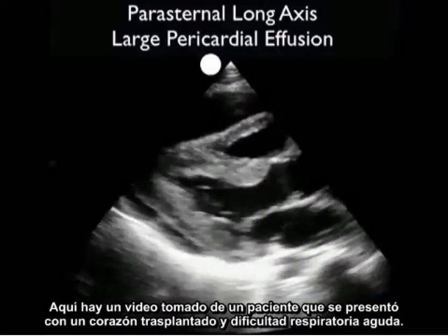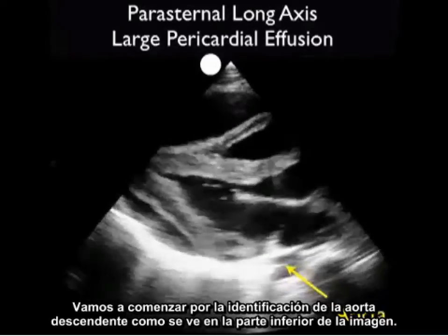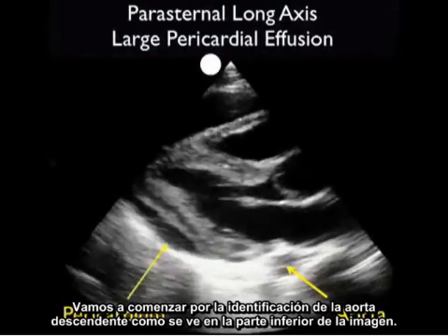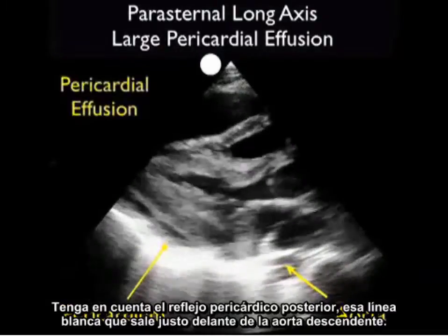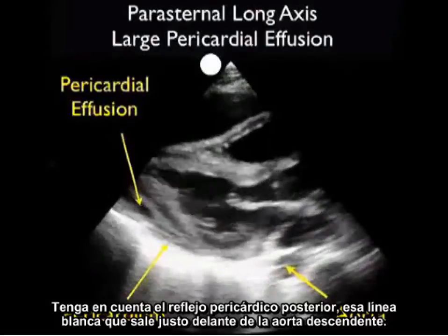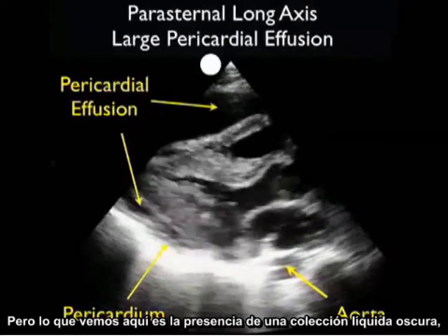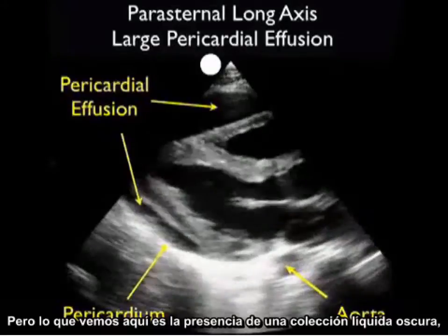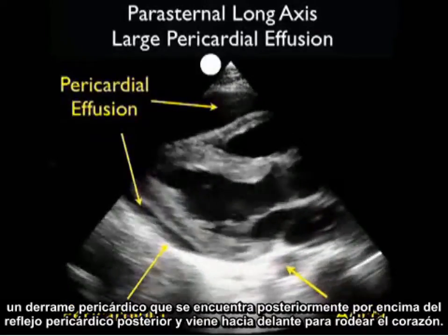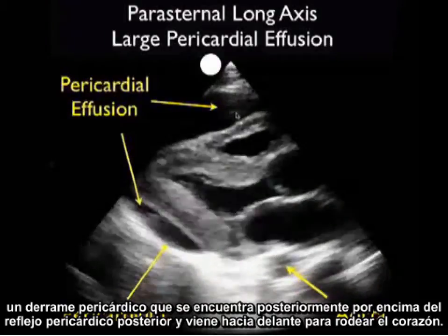Here's a clip taken from a patient who presented with a transplanted heart and acute shortness of breath. We'll begin by identifying the descending aorta at the bottom part of the picture, then note the posterior pericardial reflection — that white line coming off just anterior to the descending aorta. What we see here is the presence of a dark fluid collection, a pericardial effusion that layers out posteriorly above the posterior pericardial reflection.